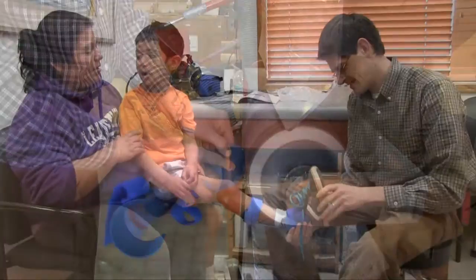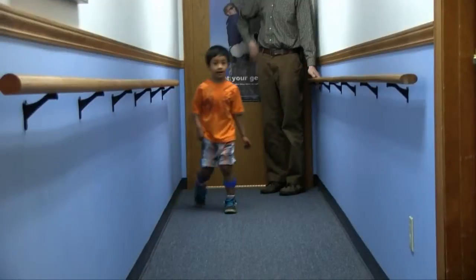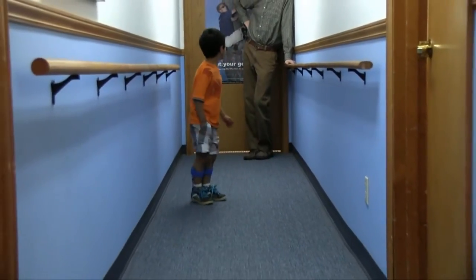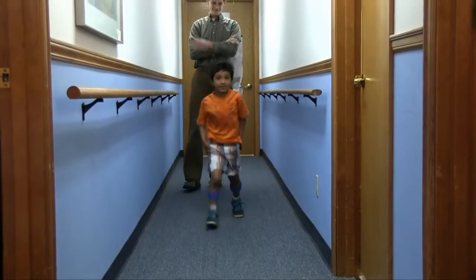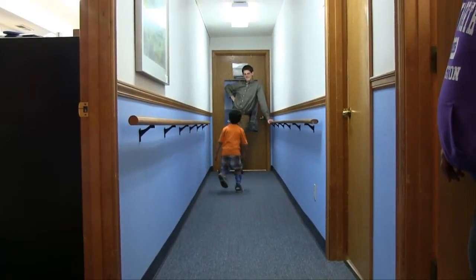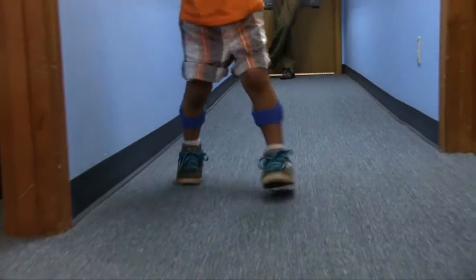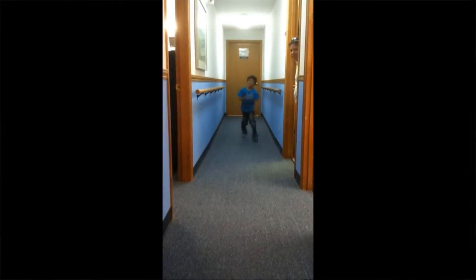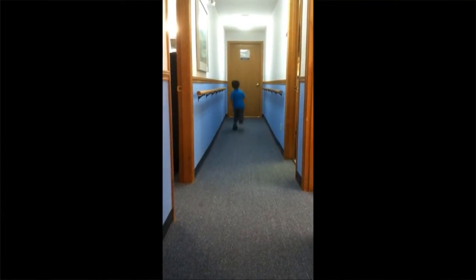That's what we're attempting today. We got him fit, and the fit looked great. His gait is good — he still kind of has this funny gait where he keeps his knees flexed, and even though the ankle positioning is really good, he can still get some toe drag, which you can kind of see in the video. But I think his gait is better, and even before any bracing, watching him run down a hall, his gait is considerably better than even six months ago. He's able to run in a straight line, almost, without bouncing off the walls. So he's making some pretty exciting improvements, and I'm hoping that the DAFO three and a half will be a good solution for him this time around.